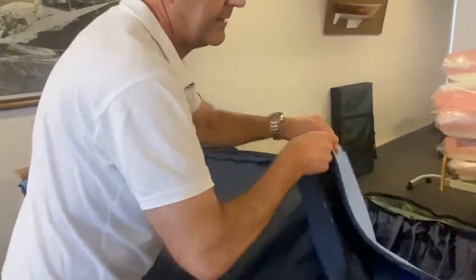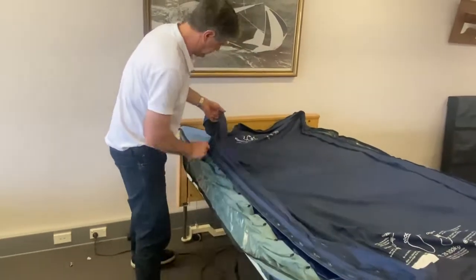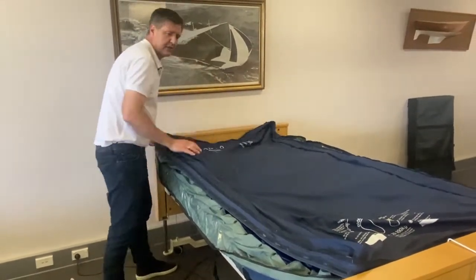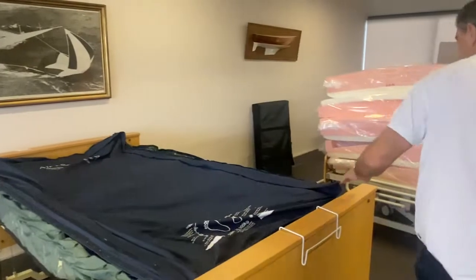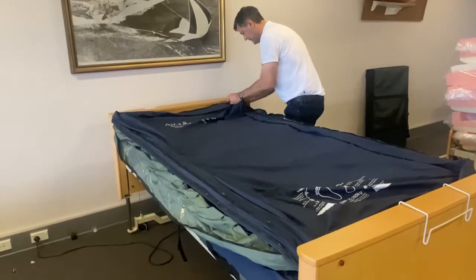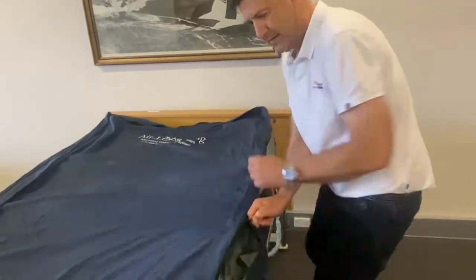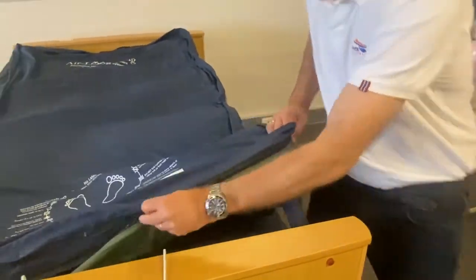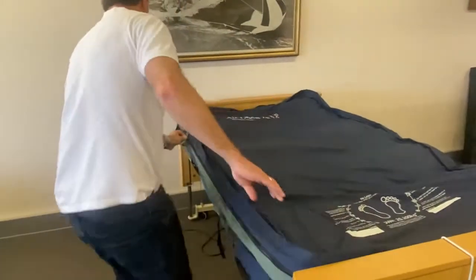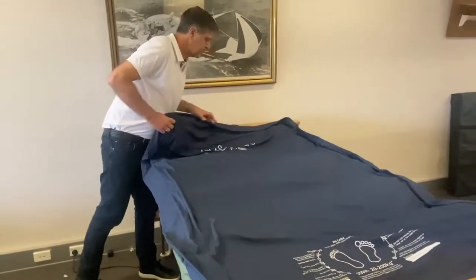So now we zip it around. So now the coverlet is now zipped to the top cover. And then once that's completed, you can then zip the top cover to the base as normal. So once that's done, there we go, in the top right-hand corner, you can now zip the top cover to the base, and that pretty much completes the installation of a looped coverlet to the King Single.